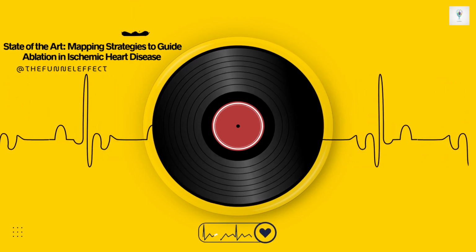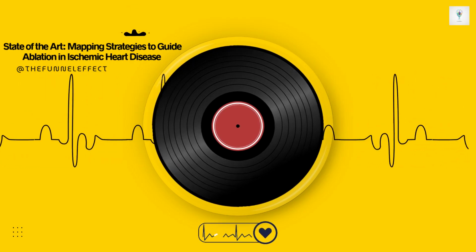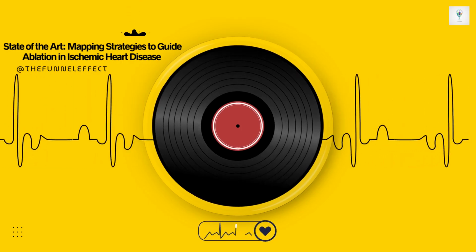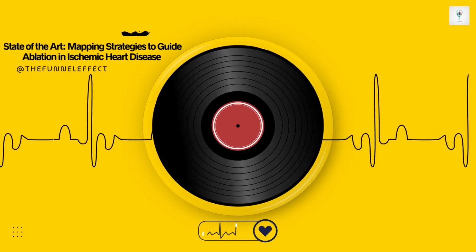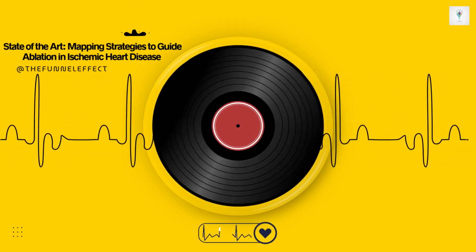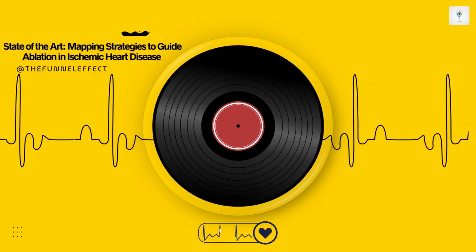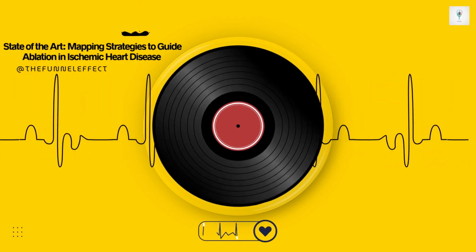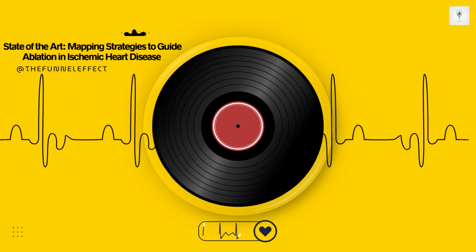The second major pitfall is misinterpreting the signals, especially dealing with far-field potentials. Remember those messy EGMs. Your catheter might be sitting near the isthmus, but also recording a large signal from a big chunk of healthy muscle further away. If you mistakenly use that far-field signal to measure your PPI, it can make the PPI look artificially long, fooling you into thinking you're outside the circuit when you're actually very close.